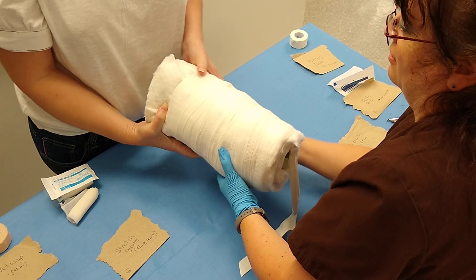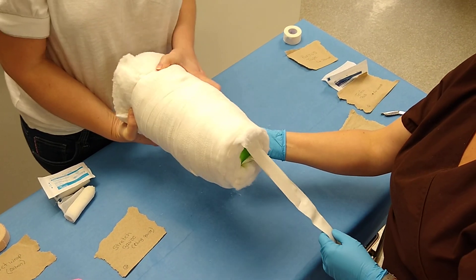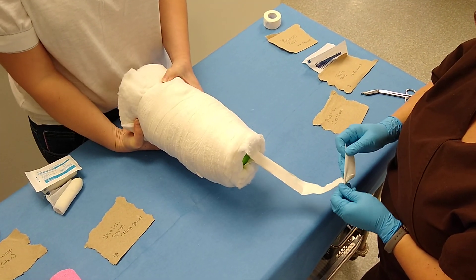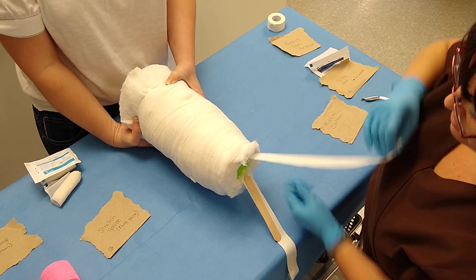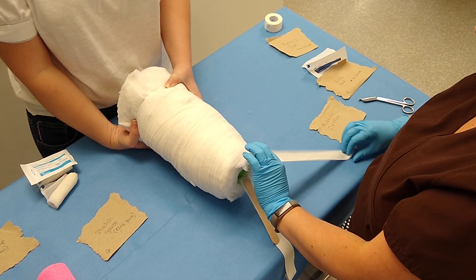Once you have your stretch gauze on, you're going to have your assistant hold the roll flat so it doesn't fling around. Take your stirrups and twist them up. You want to turn it so the sticky side is against the bandage material.